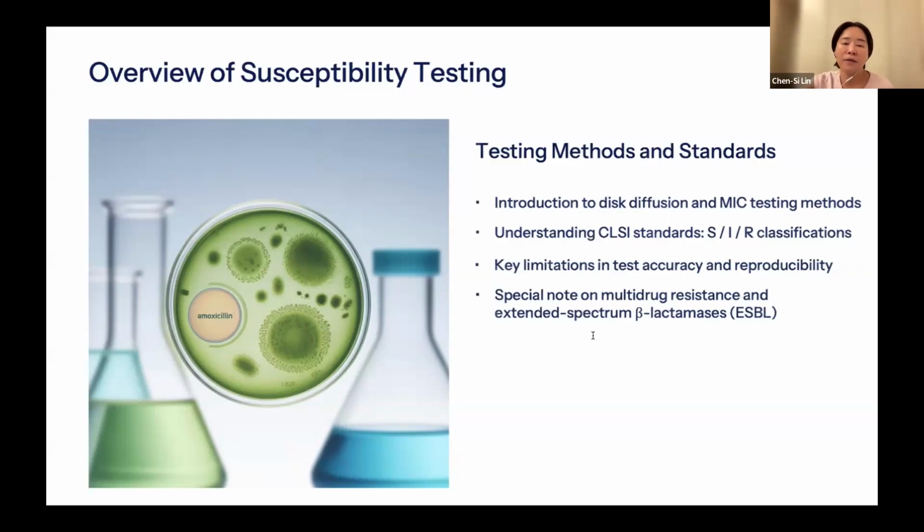To close this, I just mentioned ESBL bacteria. In culture, they show susceptibility. However, in vivo, that means in the clinical setting, they may not. So it's very special that ESBL organisms can appear susceptible in standard testing, but behave differently in vivo. On the report, you can see they are sensitive to specific drugs, for example cephalosporin. However, clinically, if you treat the case with cephalosporin, it still has no effect. So this makes correct detection and cautious interpretation extremely important.